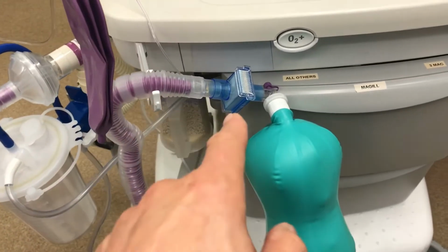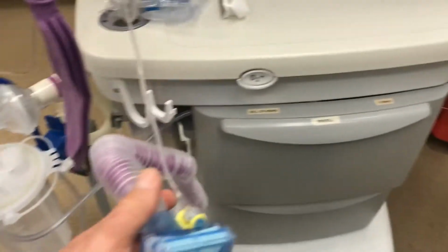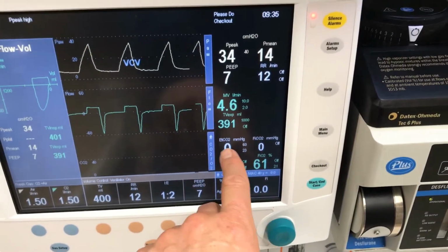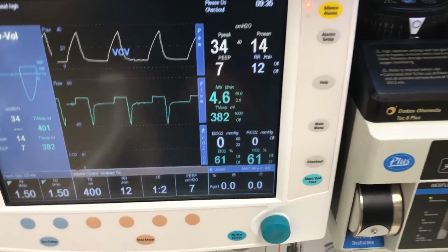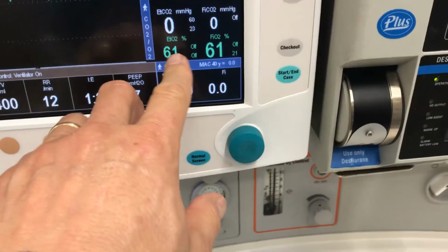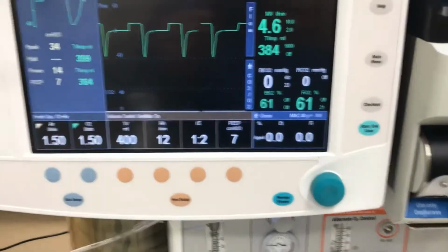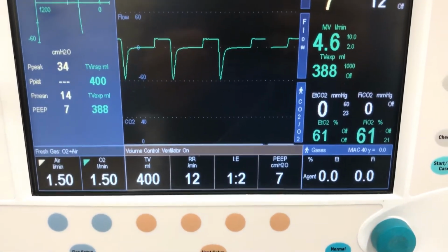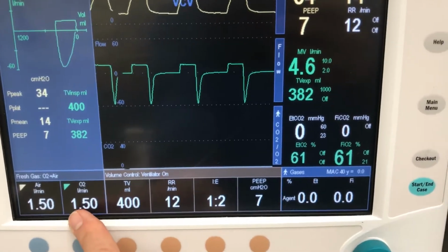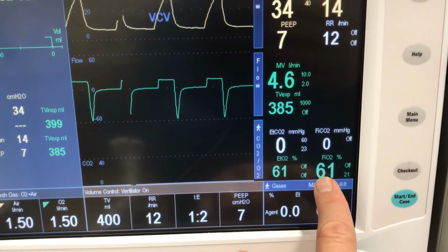In this situation, however, measuring the patient gas, which comes through this spirometry back into a gas sampling module, and then gives us our actual FiO2 and end-tidal CO2s, tells us that our fresh gas flow, which looks like it's 50-50 here, does not always match what's actually at the patient, and that's just due to the rebreathing process. So one of the things that we'll mostly have to watch for is making adjustments in the fresh gas flow over time to make sure we're getting the desired FiO2.